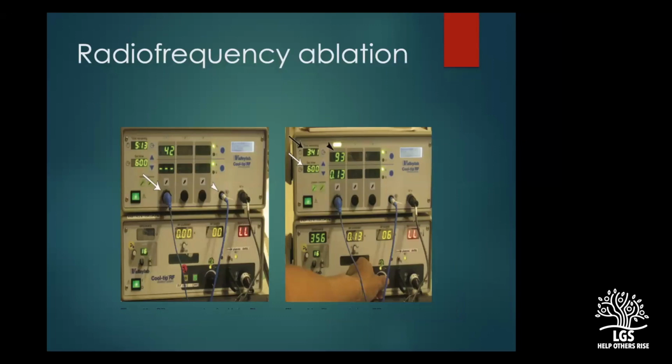The next treatment modality that I wanted to talk about was radiofrequency ablation in a pre-transplant scenario. Radiofrequency ablation, again, I think people have got this misconception about the fact that there can be tumor seeding when we penetrate the capsule. So at our institute, we don't actually offer ablation pre-transplant, but I'm sure there are a lot of other institutes wherein they offer ablation, whether it is RFA or microwave ablation. They offer ablation pre-transplant as well as a bridge to transplant, because again, the technology is fairly advanced now.